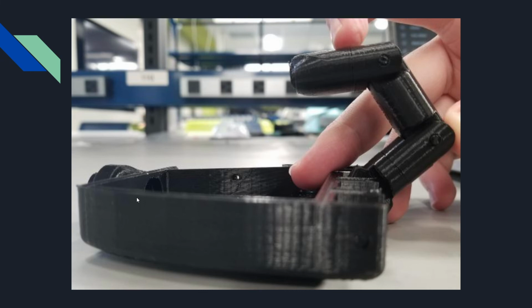So we're going to hopefully have all of the fingers on and attached correctly by the end of this week. One of the small issues, which is the reason why we're reprinting, is that some of the holes on the inside of the fingers, where the fishing line will eventually go through, were a little bit warped or had something blocking them, which is of course a bad thing, as the fishing line does need to go through it cleanly.